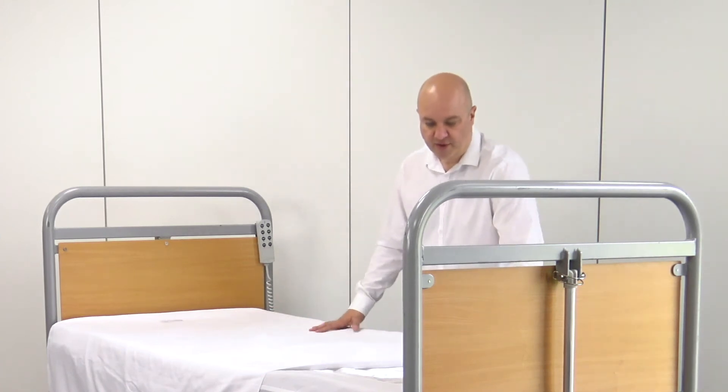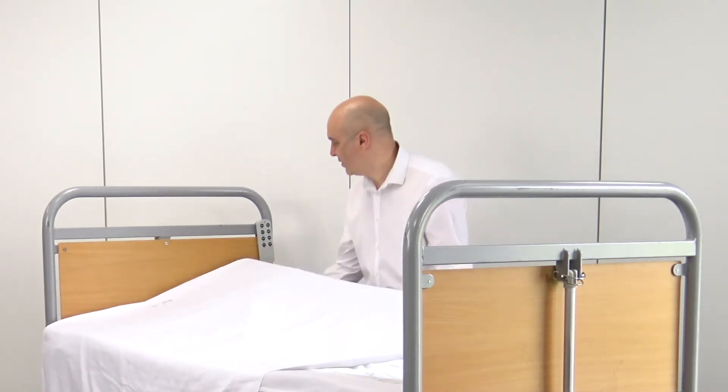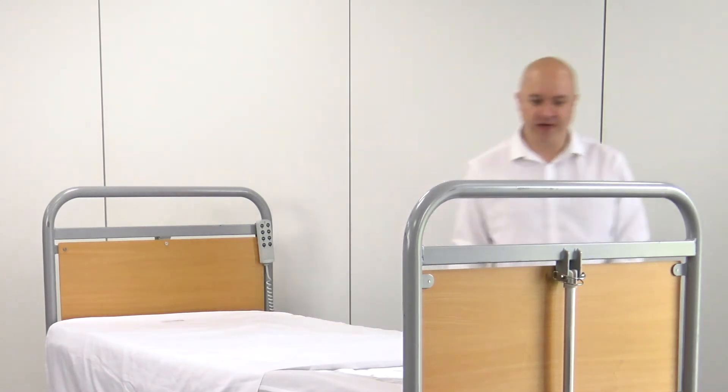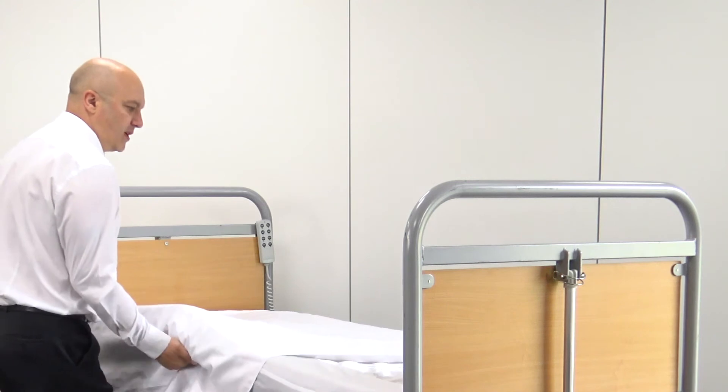I'm going to tuck this top sheet in, which is what we'd do if we had somebody lying on the bed and we just want them to move around. And then I'll get my pretend patient to come and lie on the bed for me.